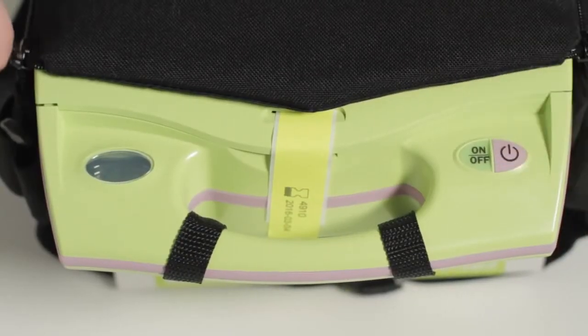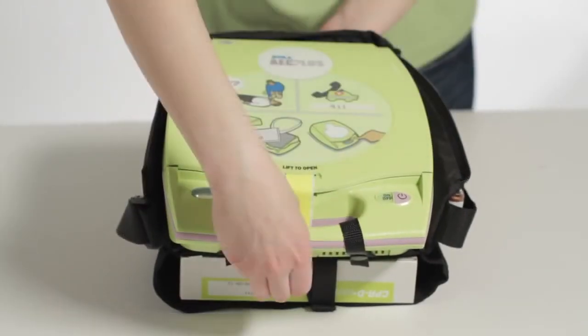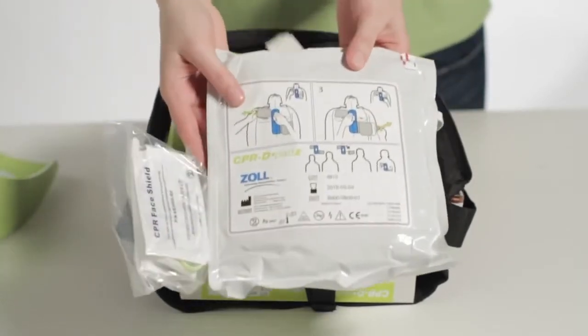You can even turn on your AED Plus and use it in an emergency without having to remove it from the carrying case. Check responsiveness. Call for help. Attach defib pads to patient's bare chest.